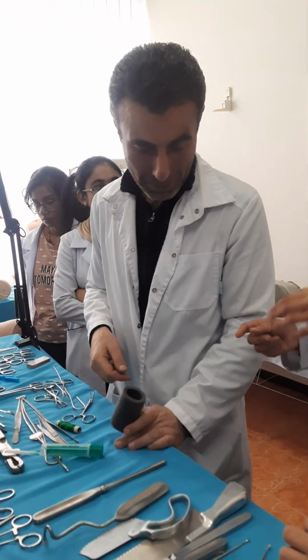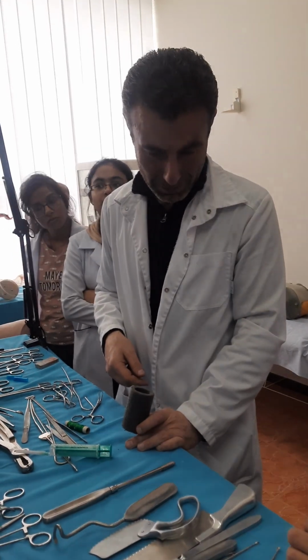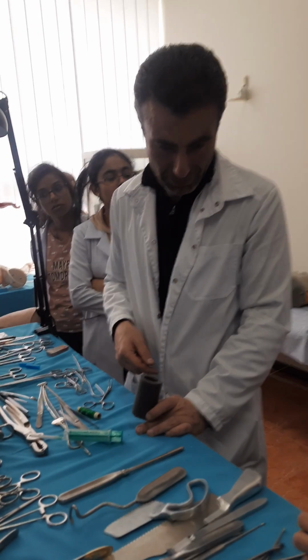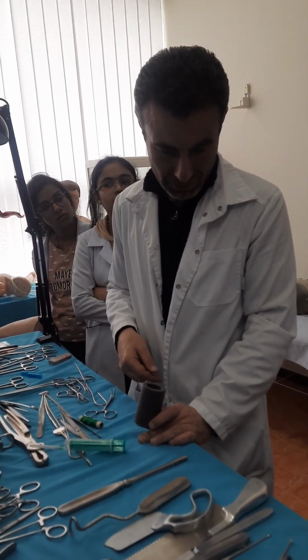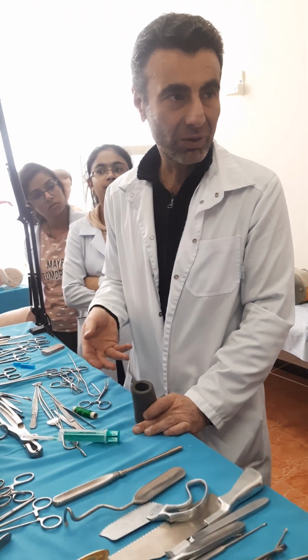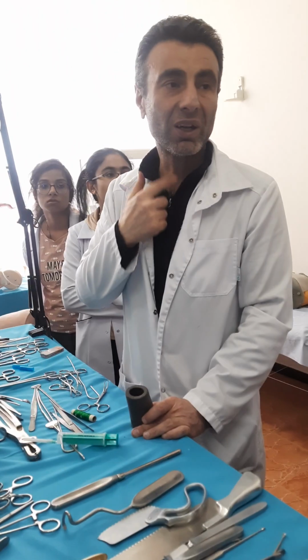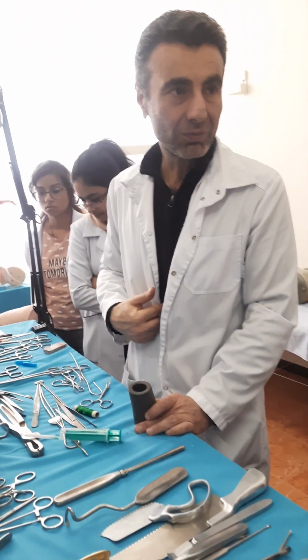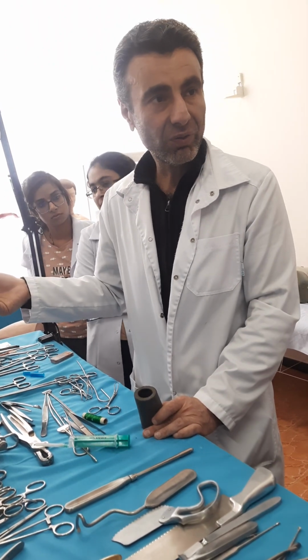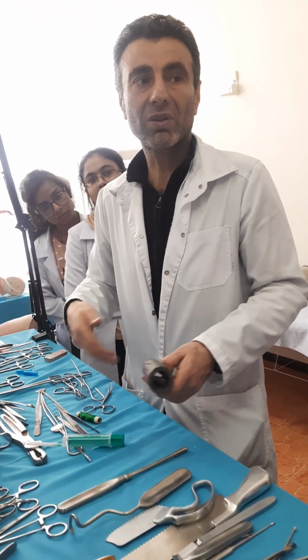Yes, I was asking, is it the same? No. There is some tube that is inserted inside the throat for injecting food. Nasogastric. You mean nasogastric catheters, for example? From the nasal cavity, we can insert a catheter into the esophagus, into the stomach, to evacuate something, or to inject something, for example, liquid food.